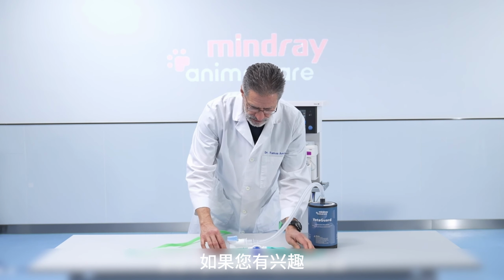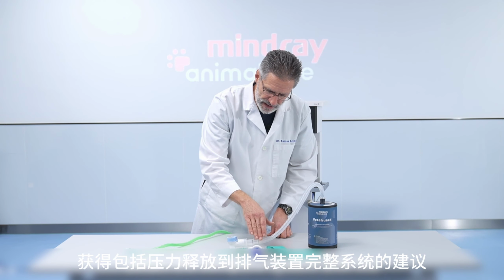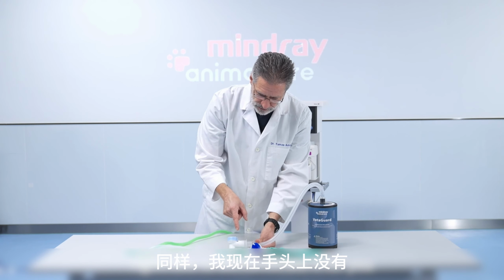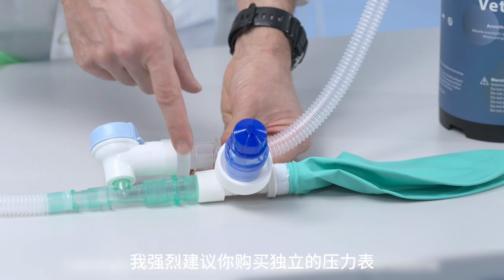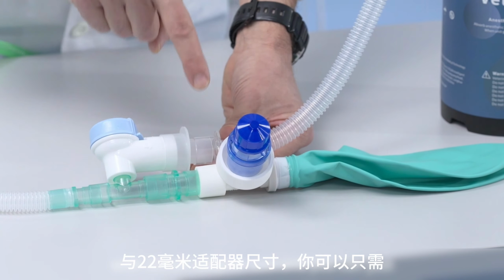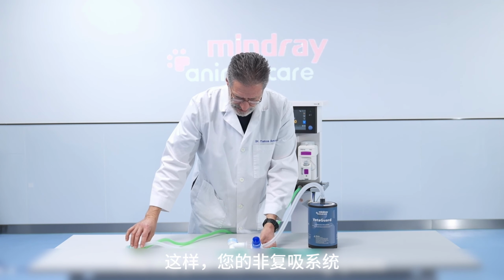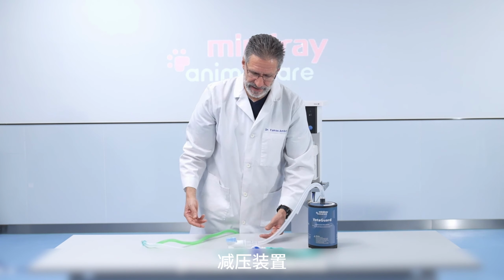And if you are interested, I can help you with further advice on how to obtain the complete system with the pressure relief adapter and the scavenging cup. Similarly, I don't have it here right now to demonstrate it for you, but it's available in the market. I strongly recommend that you purchase a standalone pressure gauge with a 22 mm adapter size, and you can just attach it right here and include it in your non-rebreathing system. This way, your non-rebreathing system will have a pressure gauge and an extra pressure relief device.